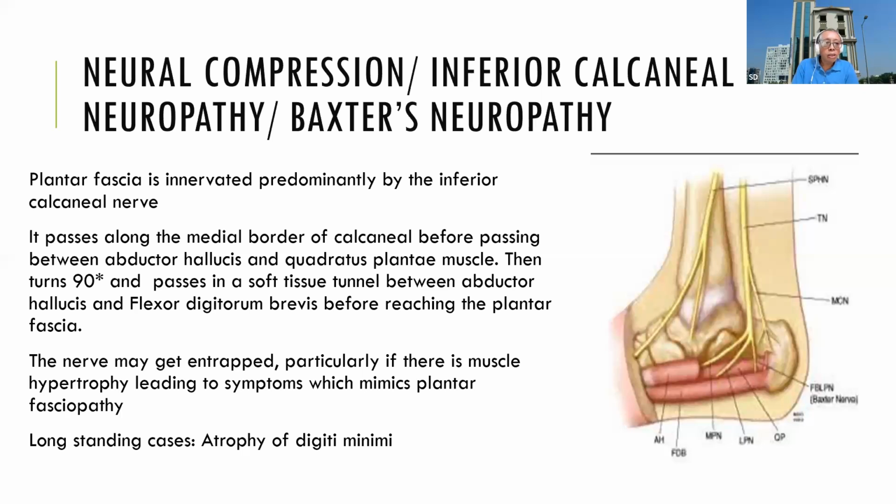Okay. Another pathological condition which is very common in day-to-day clinical practice is heel pain secondary to nerve compression. So neural compression, especially of the Baxter's nerve, which is also called the inferior calcaneal nerve. If there is any problem in this inferior calcaneal nerve, then it can mimic pain similar to plantar fasciitis or fasciopathy.